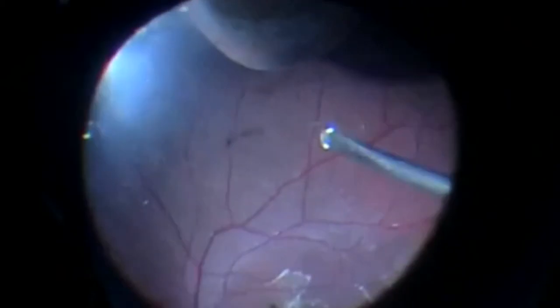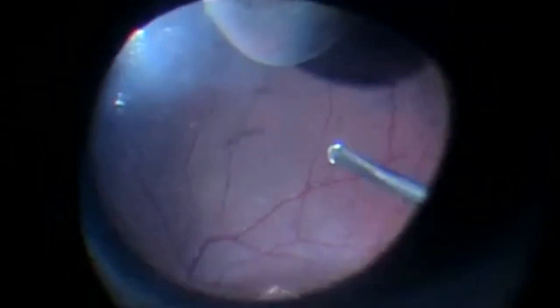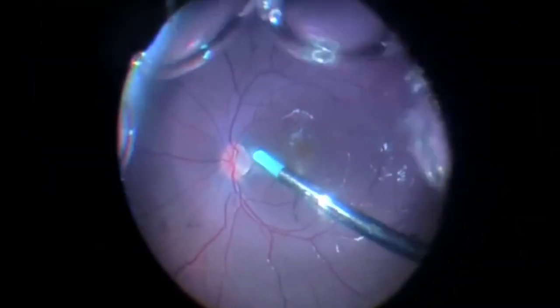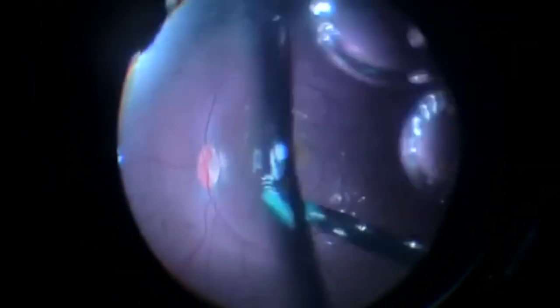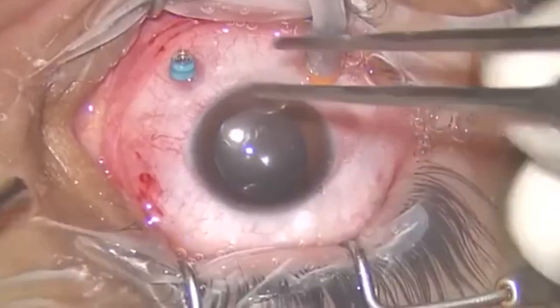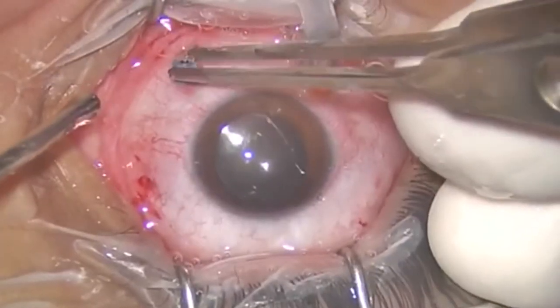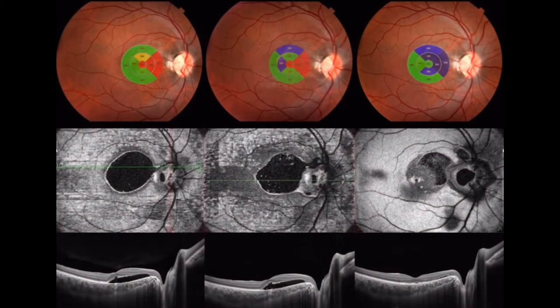In this case, the surgeon performed vitrectomy and fluid-air exchange and did not apply laser or inject gas, achieving a great anatomical and functional outcome.